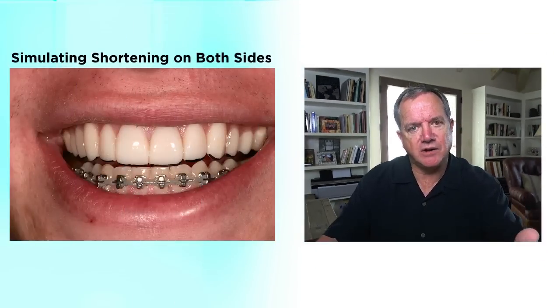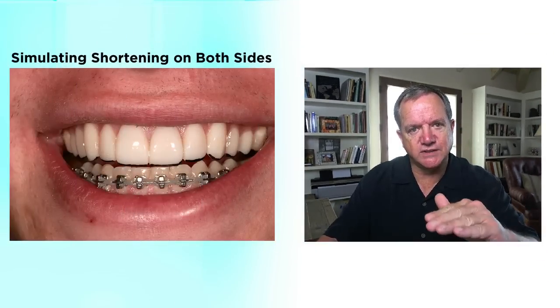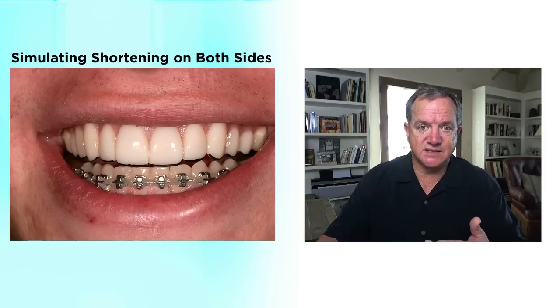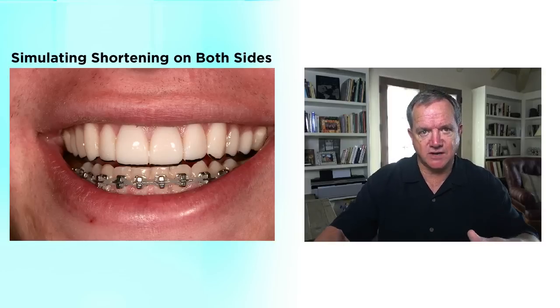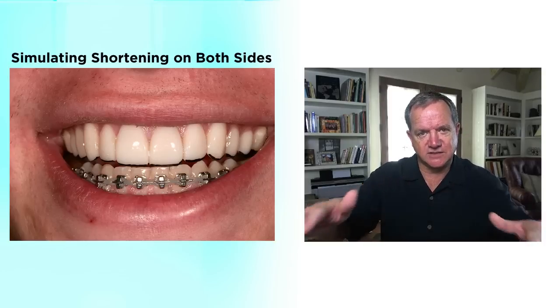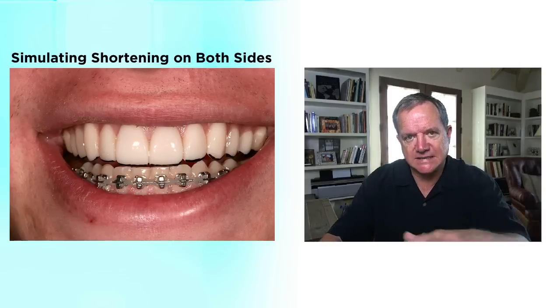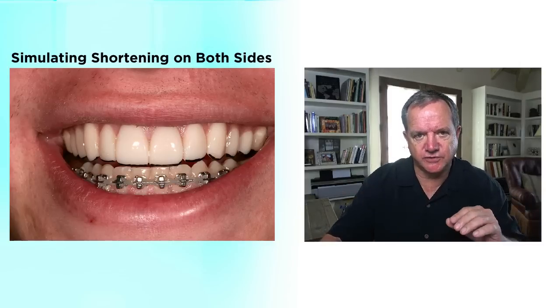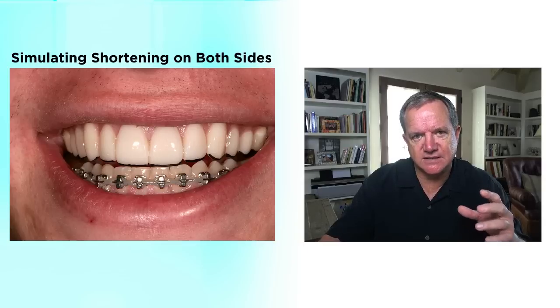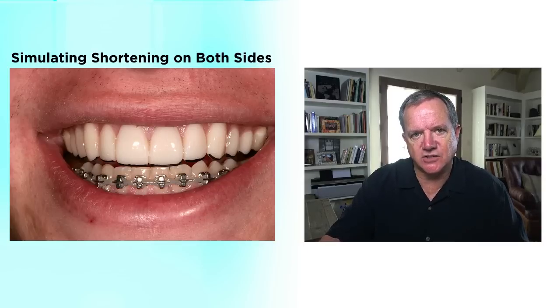If you just start arbitrarily shortening these teeth with a bur, you have no idea how much you're actually taking off or whether you're doing it level. So I always do the left side first, leave the other so you have a visual comparison. If you like what you did on the left, now you can black out the right side. I want to show you how to actually shorten the teeth and reshape the embrasures. In this case it's going to be shortening the canines and premolars as well, because if I just shorten the incisors, I'm going to get a flat or reverse smile line. So I want to maintain that curvature — I'm not just changing the central and lateral incisors.